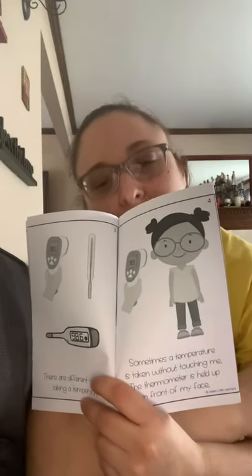There are different ways of taking a temperature. Sometimes a temperature is taken without touching me — the thermometer is held up in front of my face. Ours is similar to this one; this is the kind that we have at school.